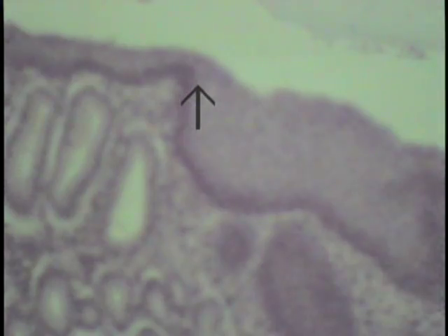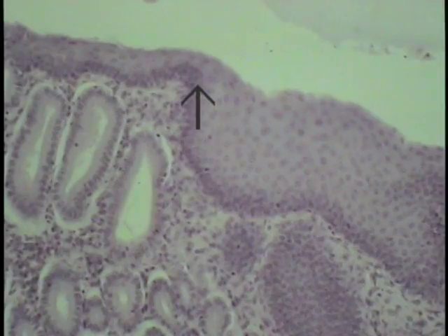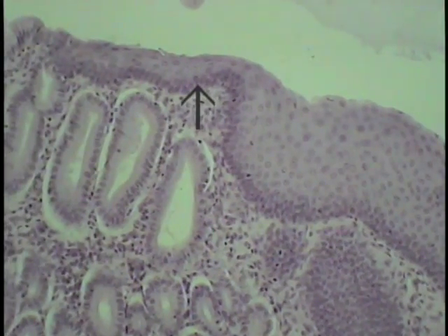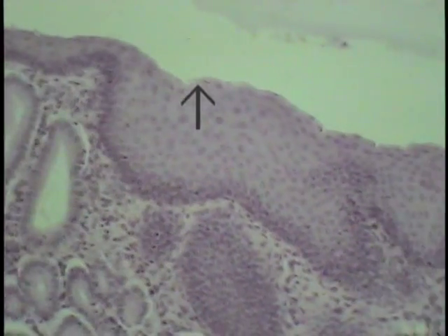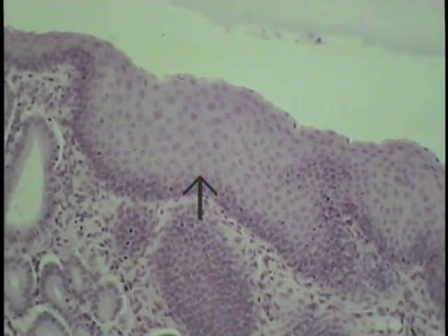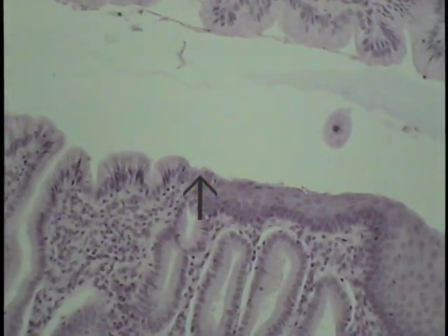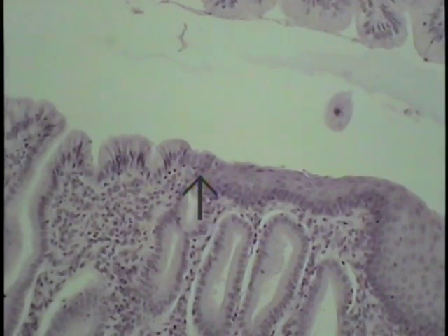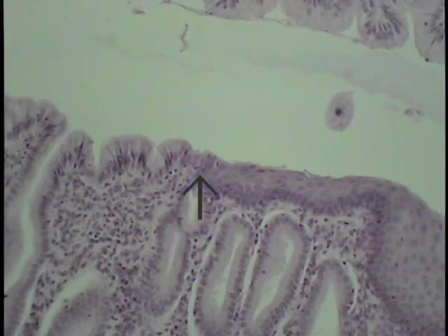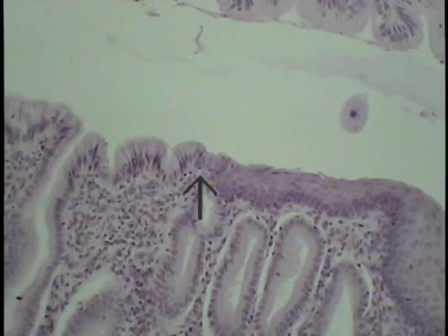The gastroesophageal junction seen at a slight increase in magnification. Normally, the stratified squamous type of epithelium doesn't decrease in depth as it does in this particular section, but nonetheless, this is what this particular region looks like. Here it has a fairly decent depth. For some reason, it's thinned out just a little bit over a short point, and then over just a single cell length, it very abruptly changes to that simple columnar lining epithelium, so typical of the gastric surface or the gastric lining epithelium. So this is the esophageal gastric junction, that abrupt transition seen at a slight increase in magnification.